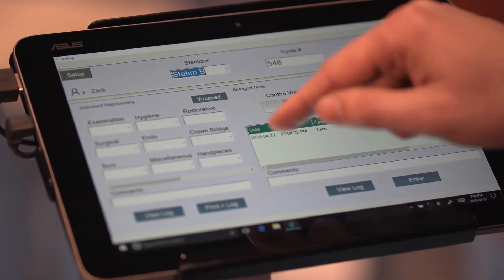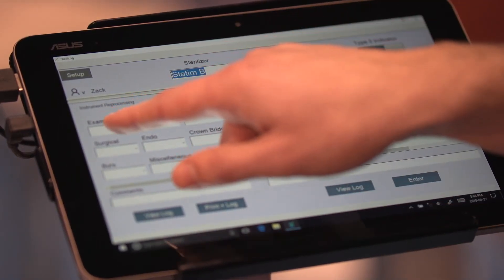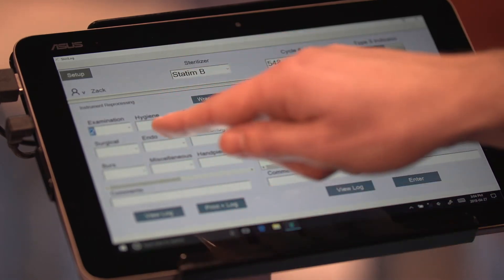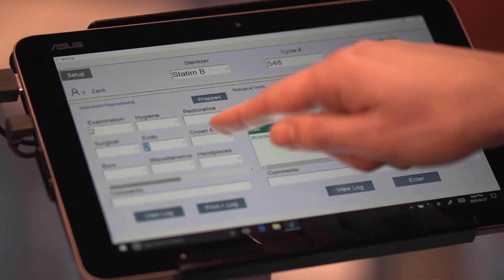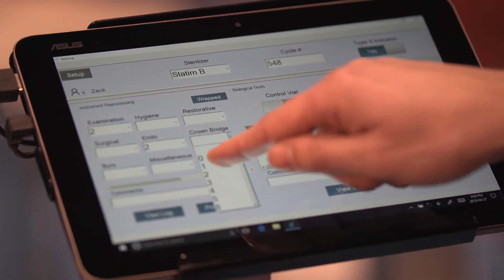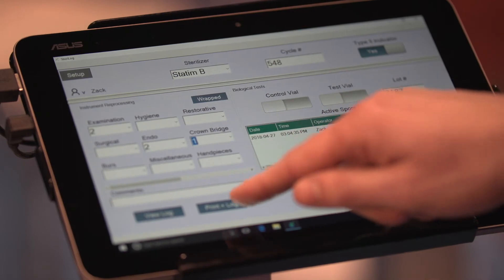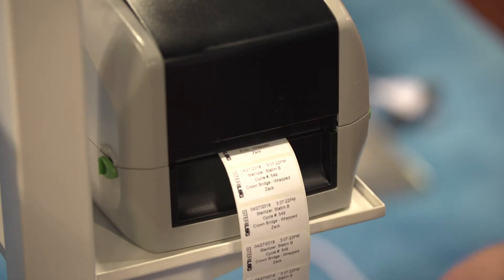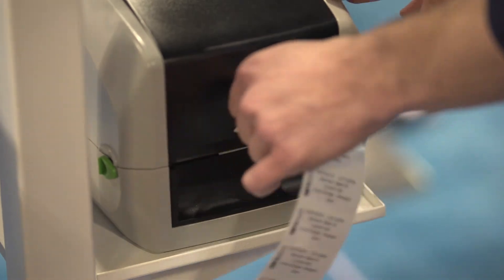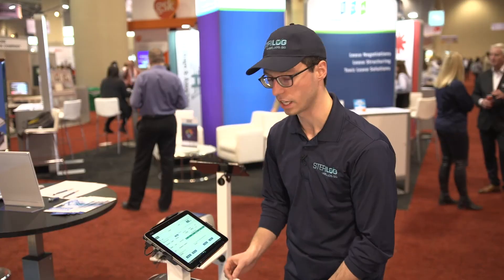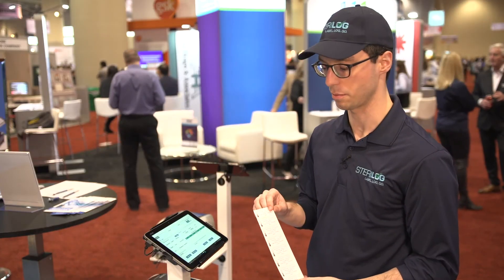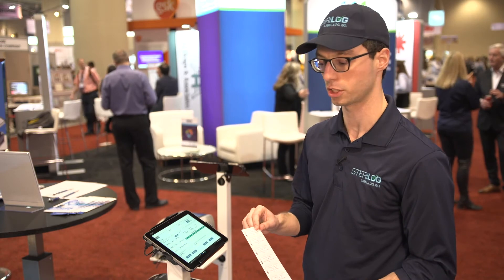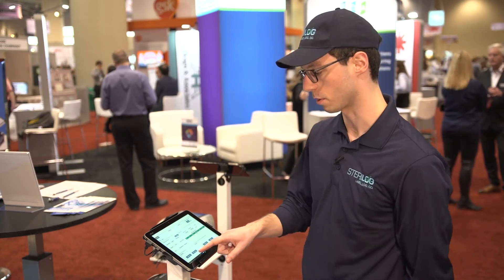I'll then enter my first cycle — I'll pick my instruments: two examination kits, a couple of endo kits, one crown bridge — and I'll print and log this. I'll take these autoclave-safe adhesive labels and place them directly on my packages and insert them in the sterilizer.